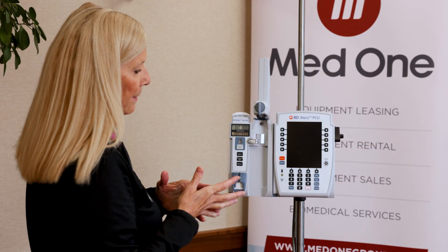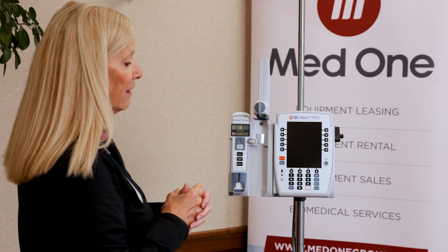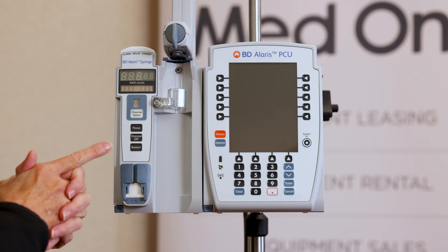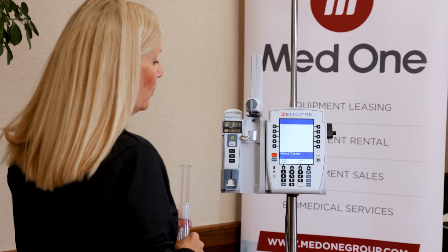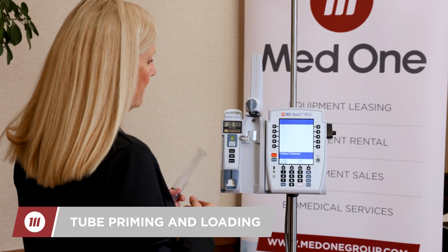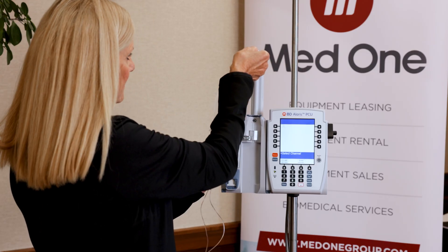The syringe pump accepts a 1 ml up to a 60 ml syringe, and flow rate ranges for the syringe pump module are 0.01 hundredths of mils up to 999 mils per hour. I'm using a 50 ml for this demonstration.